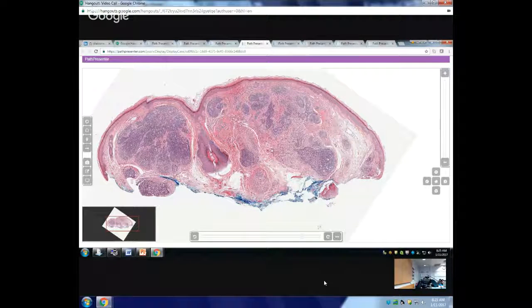Now I ruled out the basal cell carcinoma, and let's say you are in practice, trying to be more practical. You are 5 years down your practice, you get this biopsy, and you have to make a diagnosis. What if it is a trichoepithelioma? The clinician doesn't have to do anything. Even if you miss the diagnosis, it's not going to be a big deal.